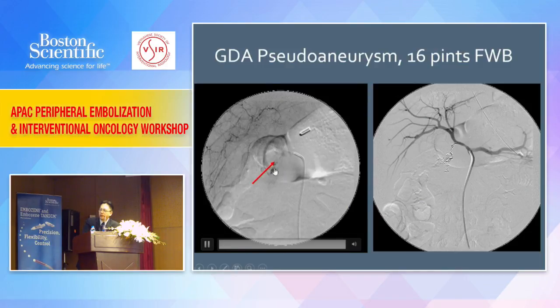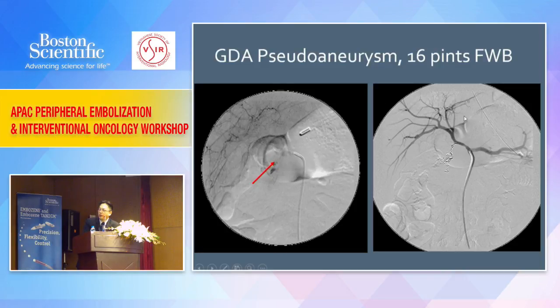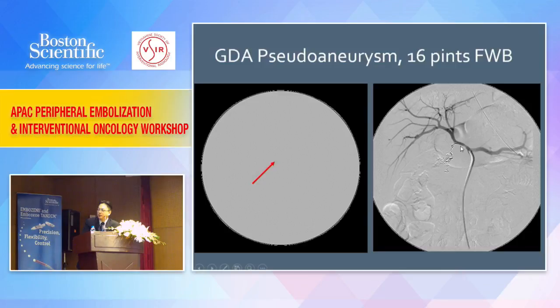On the table you can see an actively bleeding gastroduodenal pseudoaneurysm, which was coiled, and immediately the bleeding stopped. Right? We used a pushable coil. My fault, because you see, there's a coil tail coming back. These are situations where, when just pushing hard to stop bleeding, we didn't have much time to think of getting a detachable coil at that time, right?